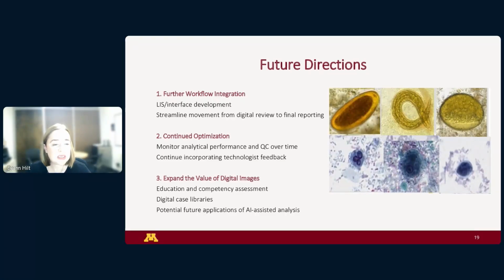But I think the biggest thing, especially for us at the academic medical center, but really for training new technologists in general, is that we can use these digital images to help train our staff for education and competency. We can create digital case libraries. So again, we're expanding the breadth of tools that we have to really train the next generation of technologists, and even our clinical providers as well.